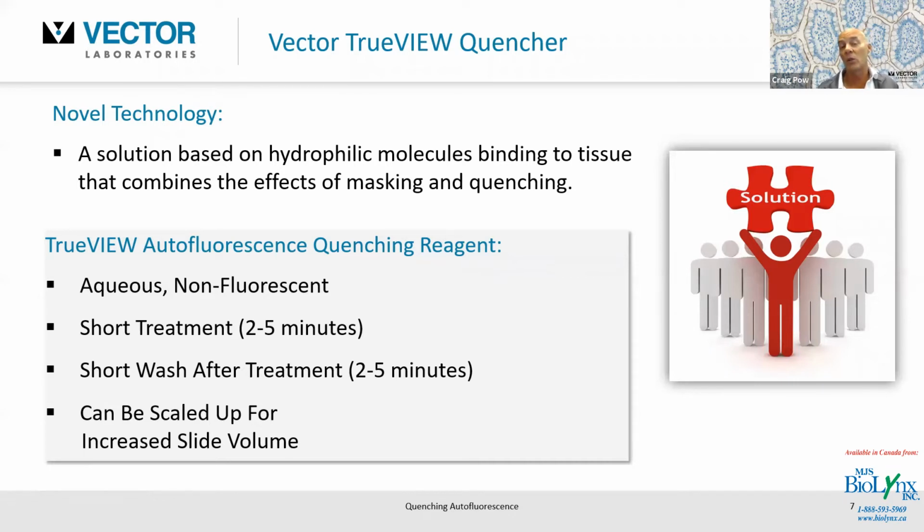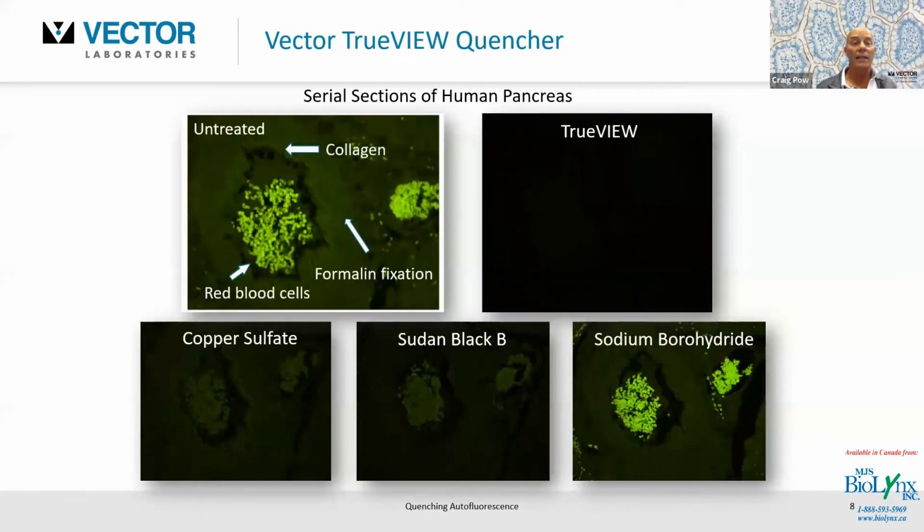Very short treatment of about 2 to 5 minutes. You give a quick PBS wash afterwards, and then you can cover slip with the anti-fade mounting media. And it's very easy to scale up for a multiple number of slides. You can put it in a Coplin jar or a staining rack, something like that, and move the slides in and out quite easily. So again, going back to this original image I showed you, it's been problematic with the red blood cells, these other cellular components, and the autofluorescence due to aldehyde fixation. Here's the copper sulfate, a quenching reagent that's been used, the ink-based reagent, and the sodium borohydride.